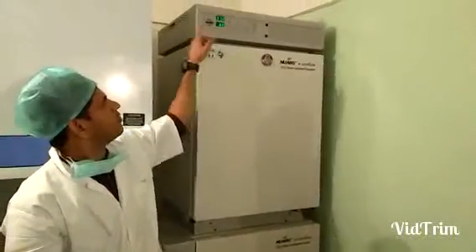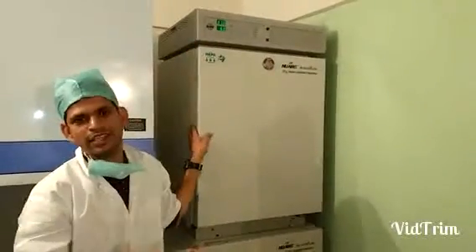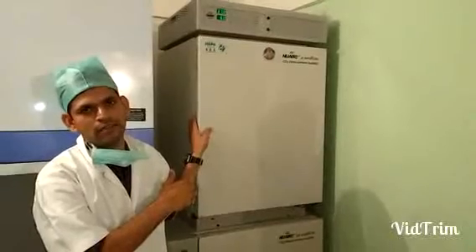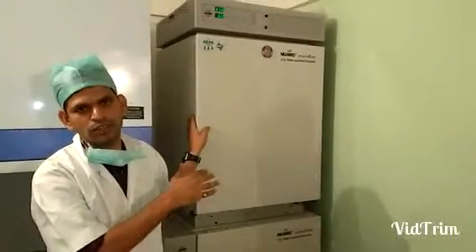The CO2 Incubator has three very important parameters. The first parameter is the temperature, which is always set to 37 degrees Celsius. We regularly check the temperature of the chamber inside to ensure that it is always 37 degrees Celsius.